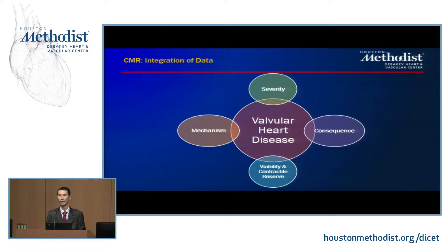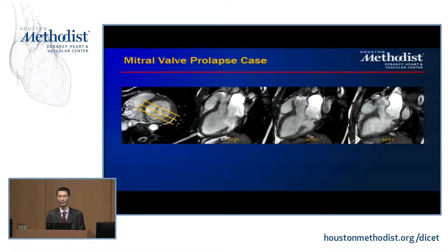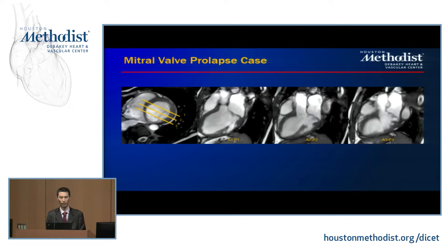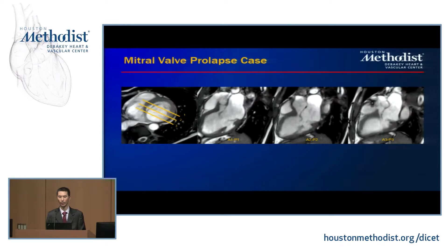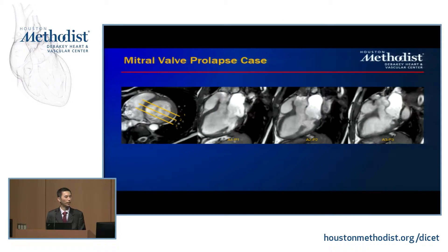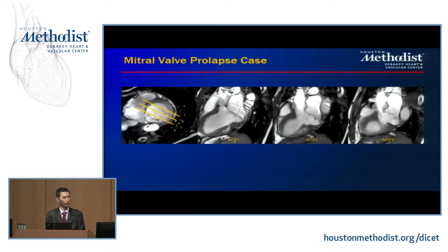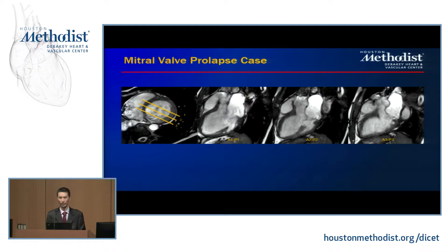Shifting to mechanism, shown here is a classic case of mitral valve prolapse. We can set a number of short-axis and long-axis stacks through the coaptation zone of the mitral valve and assess all segments along different parts of the valve. In this case, the prolapse is predominantly involving the A2-P2 region.